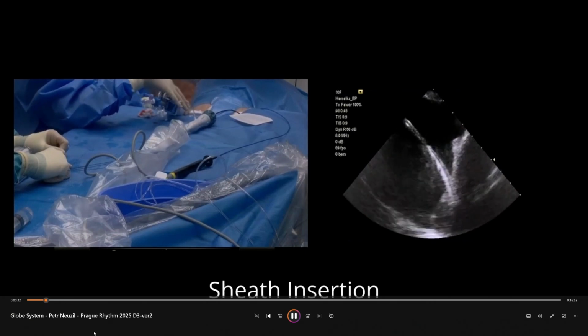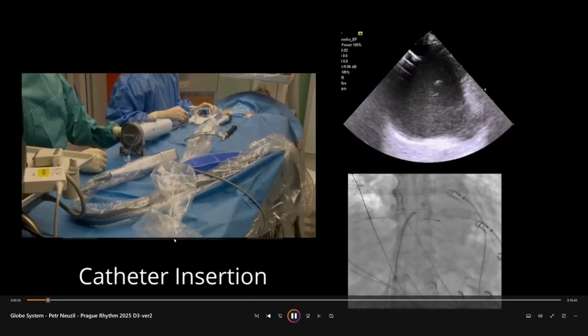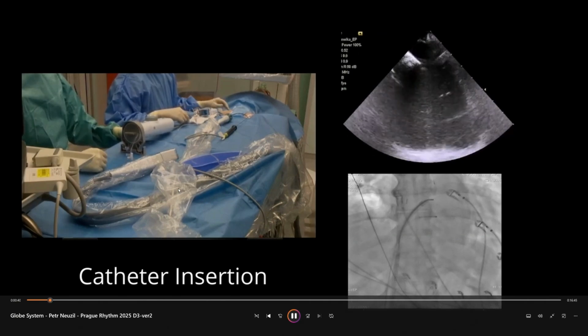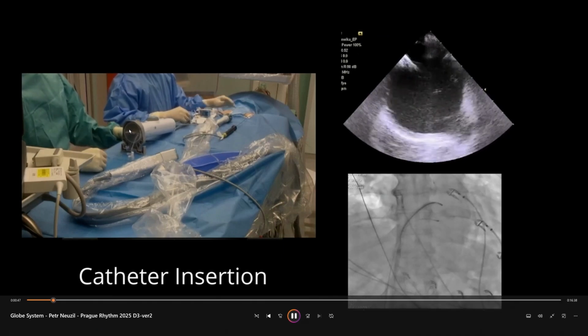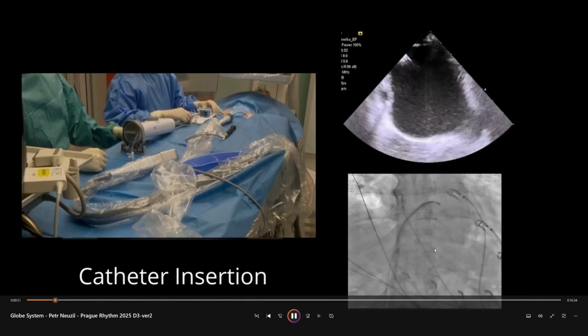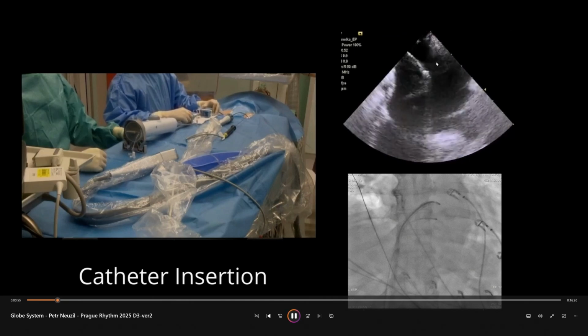Now the dilator is already facing the septum. Now we are inside with the sheath, and we are ready to go with the system inside. You will see in a minute. Okay, now we are ready here.